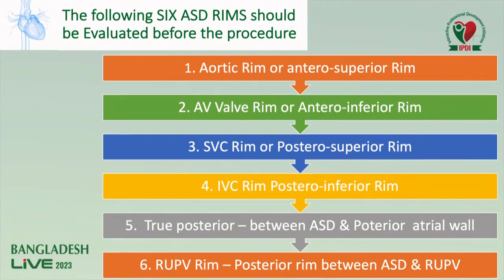The following rims should be evaluated before the procedure: AV valve rim or anterior inferior rim, aortic rim or anterior superior rim, SVC rim or posterior superior rim, IVC rim or posterior inferior rim, true posterior rim between ASD and posterior atrial wall, and right upper pulmonary vein rim — the posterior rim between ASD and upper right pulmonary vein.